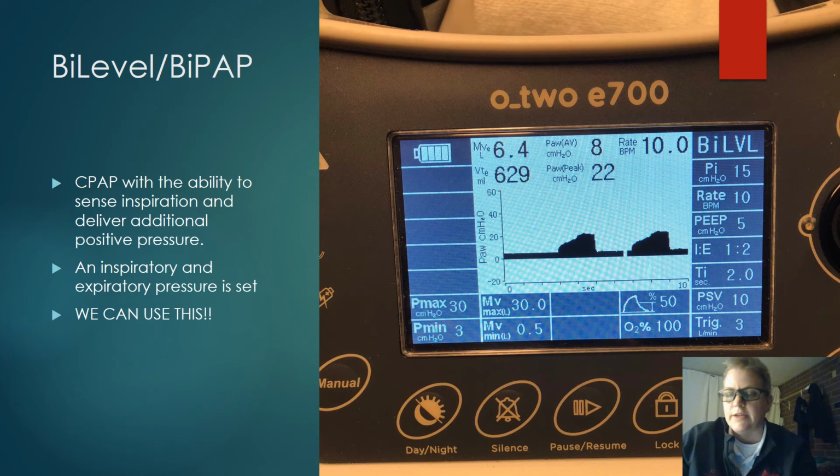We can use it. And interesting, the bilevel mode is similar to the SIMV mode with pressure support. So you set that inhalation pressure, or that PI pressure, and the exhalation pressure, or that PEEP. So the ventilator delivers that pressure control mandatory breath at a set breath per minute, okay?